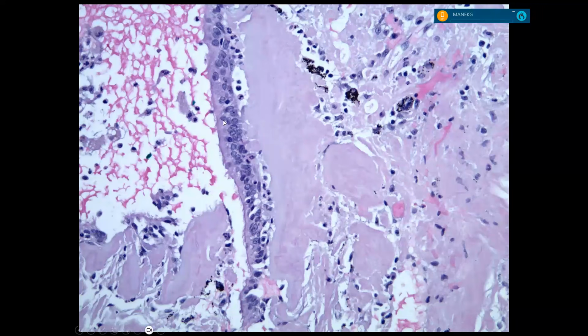You guys know what this is? See those things there? This is endometrium. Good thought, but it's not. What am I pointing at here? Cilia, right? You wouldn't get that in endometriosis. It's bronchial epithelium, right? So you can kind of ignore that and now look at the other stuff in this. Goblet cells? There aren't any here, I don't think.